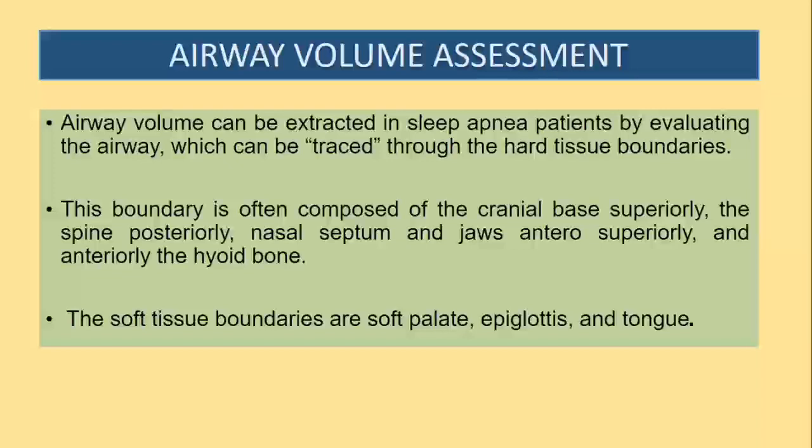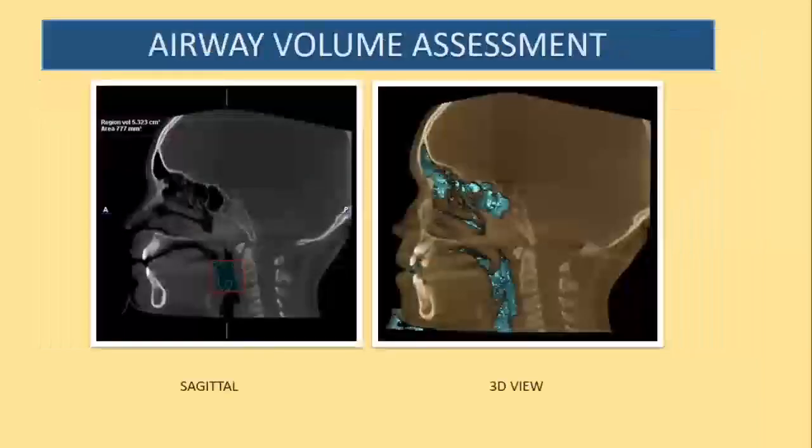And the reason why I'm emphasizing here is that the equipment you have now has tools to identify and mark the airway. This same tool can be utilized by periodontists to mark how much bone is lost. You can actually mark the area and say, okay, so much volume of bone is lost. So that will help you, including cleft palate surgeries, in deciding how much bone is required, the material that you use. You can say, okay, this is the volume of bone I need to fill that defect.